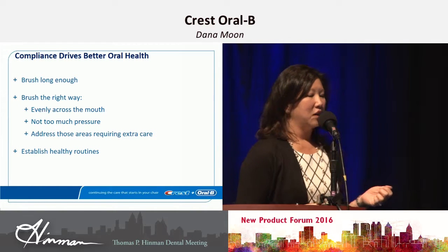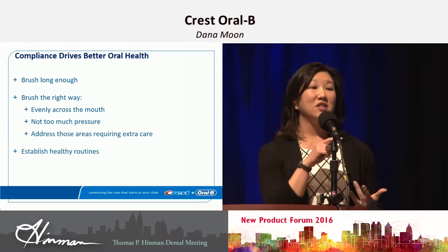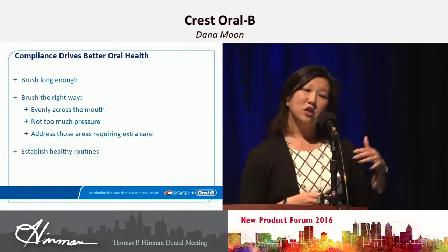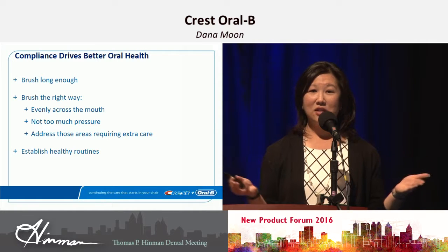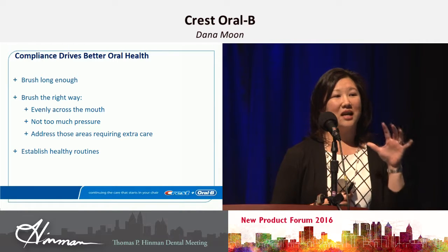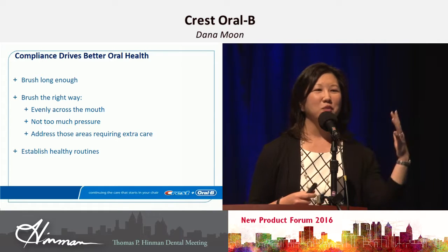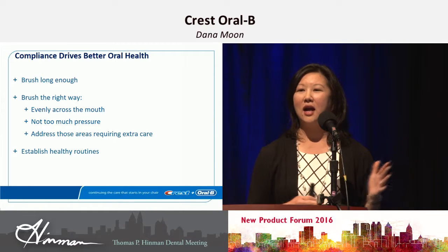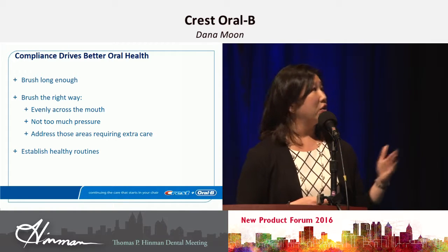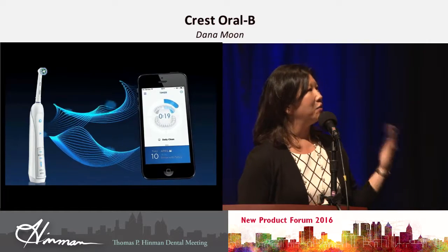And so I want to share with you a little bit around compliance, right? Some of the key factors are a lot of our patients don't spend enough time with the brush in their mouth. They're not brushing long enough. They sometimes want to put too much pressure. Have we ever seen any aggressive brushers? And maybe some adverse effects from that. And then all of them tend to not brush as thoroughly around the entire mouth. Sometimes they have their favorite spot, or our cross brushers start in one area and they don't necessarily get around to the whole mouth. So it's really important in order for us to help our patients that we provide tools that are visually appealing to them.